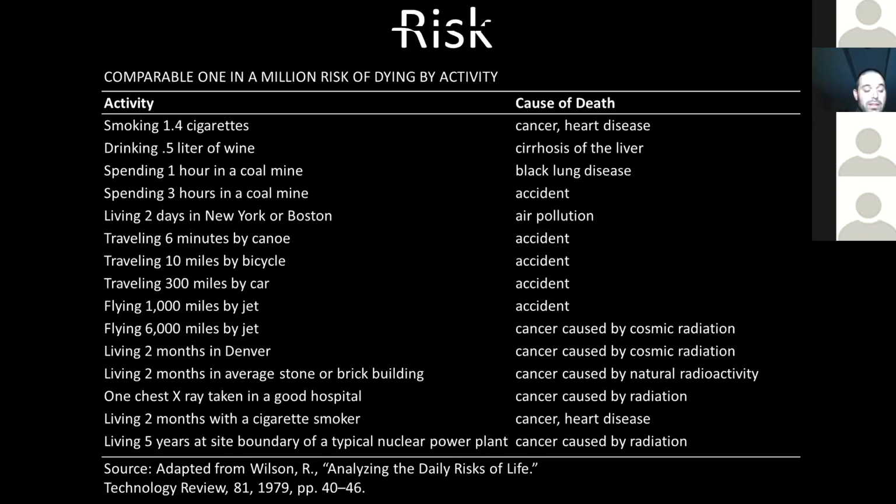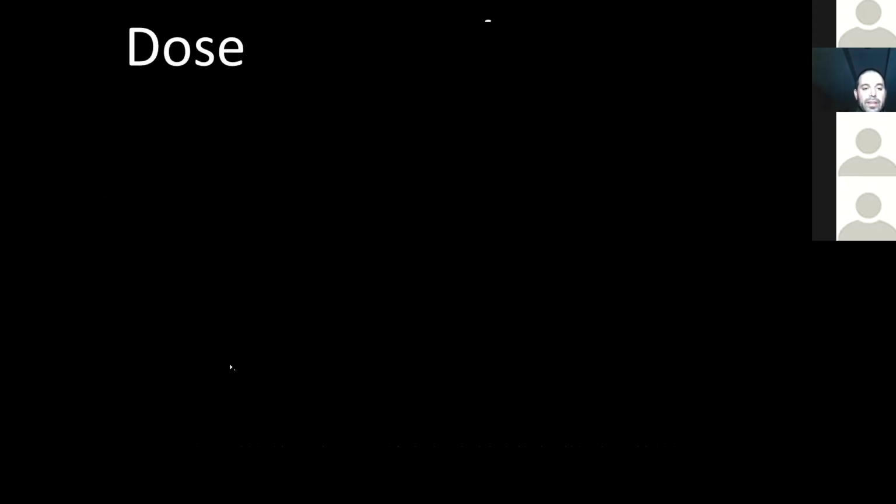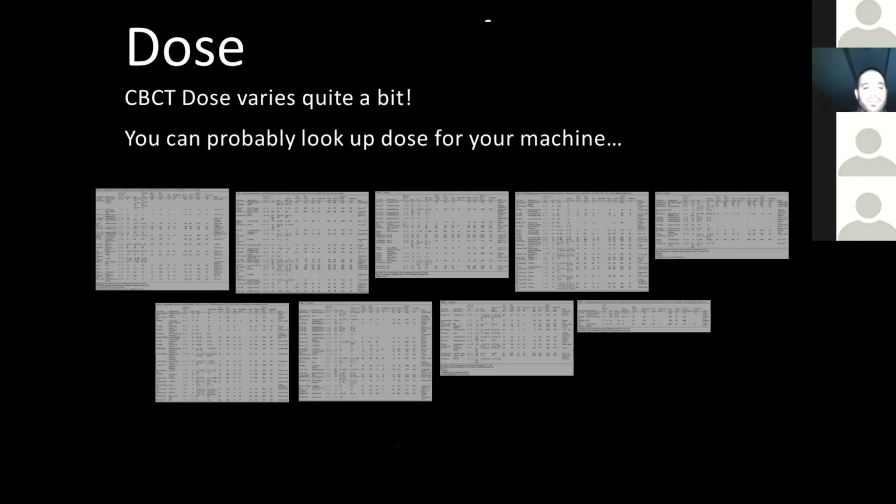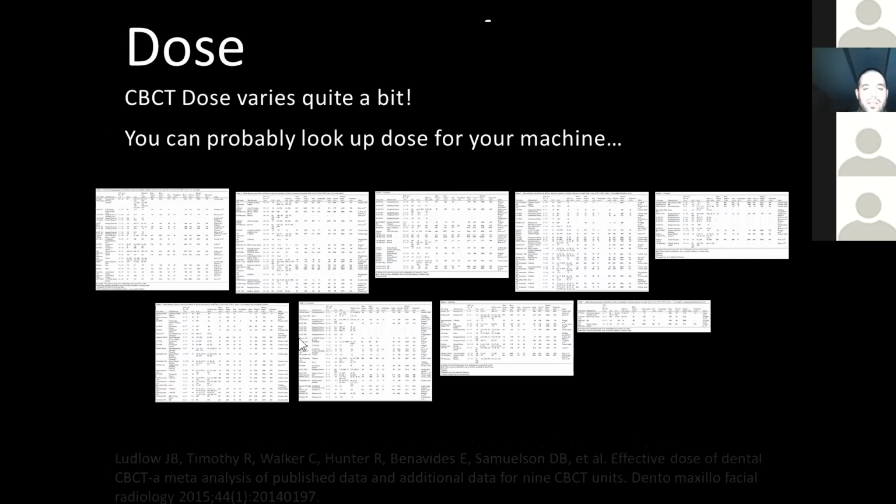That statement there, or a variation of it, satisfies most patients. Again, it's the rare patient who wants to dive into some of these statistical numbers. If you really, really want to dive further into the numbers, if you have a machine and want to look up exactly what you're doing with each protocol, you can probably find it. So there are references out there.